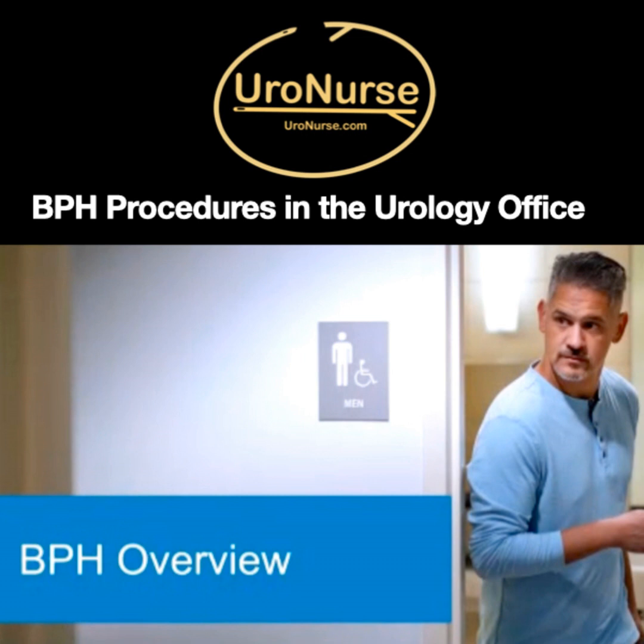Whether they're urinating great or not, visually, it looks like they had something done. The same thing when I see a post-op Rezum, you do see that big, almost a TUR defect. If you're blind to what they had done, you might say, oh, did you have a TURP? Because you'll see that defect. I've never seen that with Urolift. I can see the staples, almost like when you do radioactive seeds.